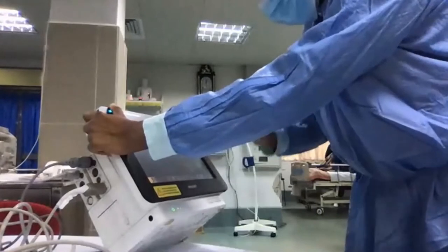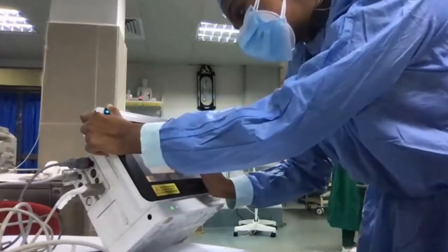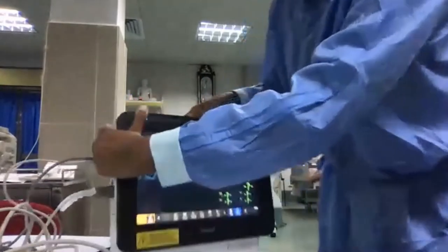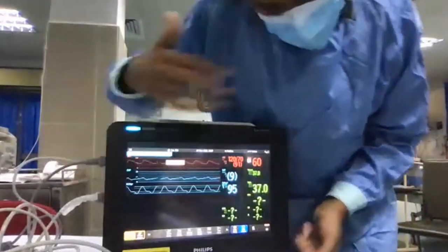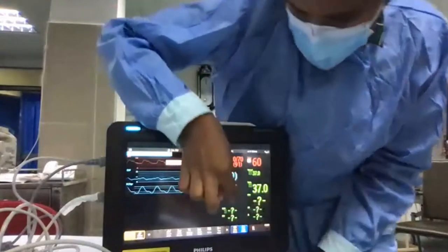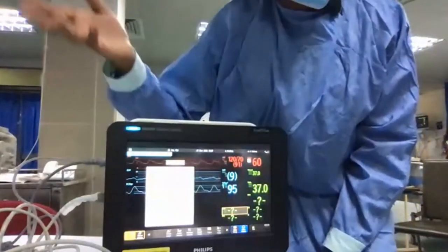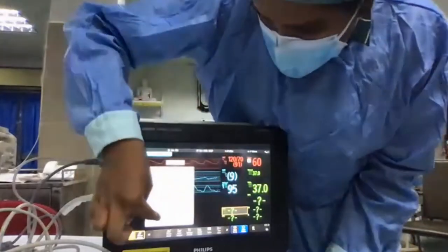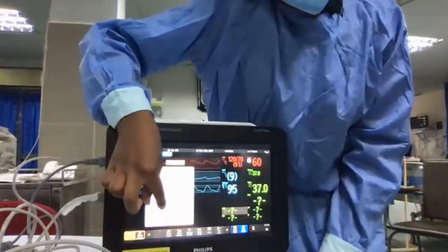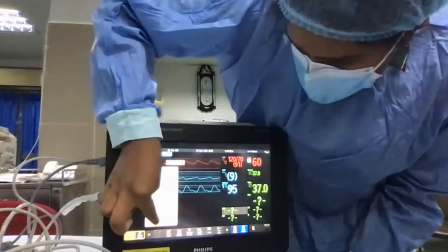That was the problem we got on that day. All right, you can do it from here. Yeah, so you have got a blank space there. Just forget about the blank space. Even if you got a green color icon like this, you can click on it. Now it says CCO, but I want EVLW or something like that. Click on it. Then you can scroll down. Then it says change numeric. Click on change numeric. Go down.